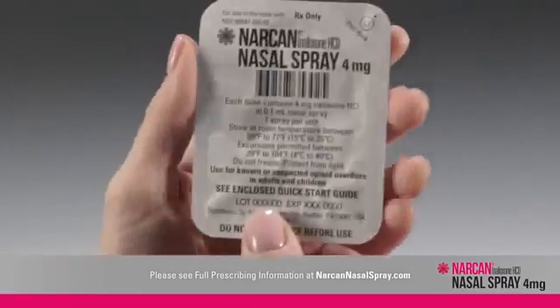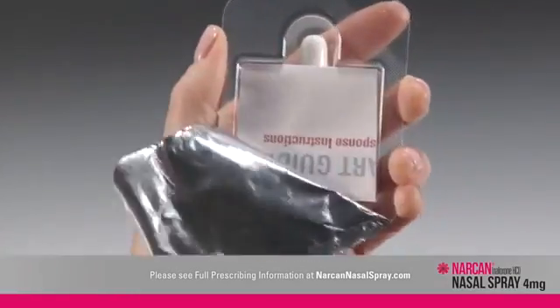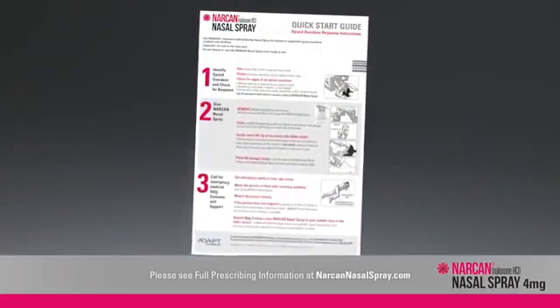Remove NARCAN nasal spray from the box. Peel back the tab with the circle to open it. Remove and review the printed quick start guide inside the package.